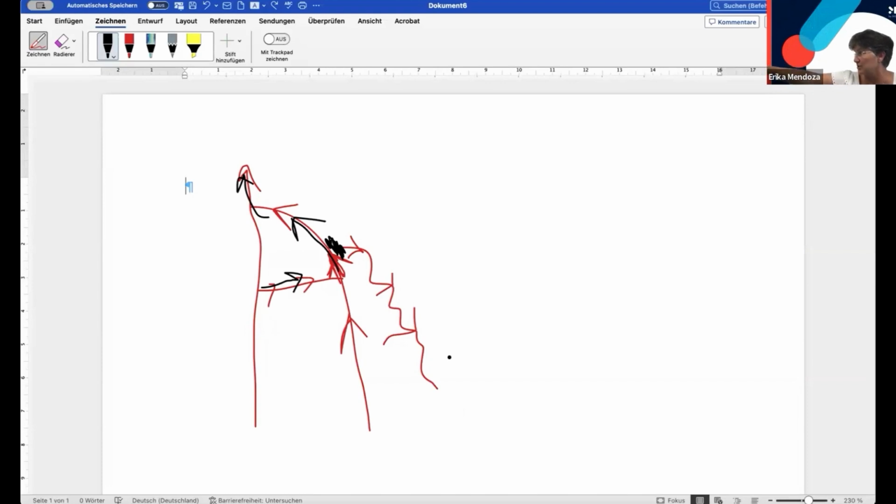I have one more patient. Yes? So you do diagnostic treatment in the same session. With your probe, she has no signs, no complaint. That's really great. Can I ask, is she on compression therapy? Yes, on calf compression therapy. He is an asymptomatic C2 patient.